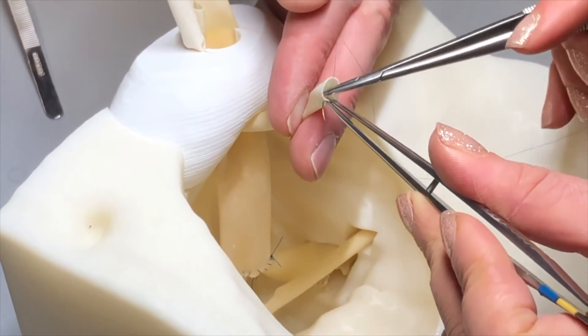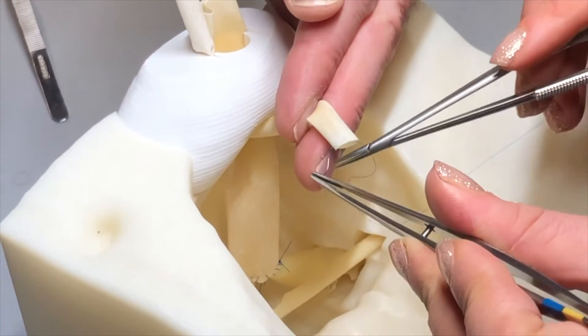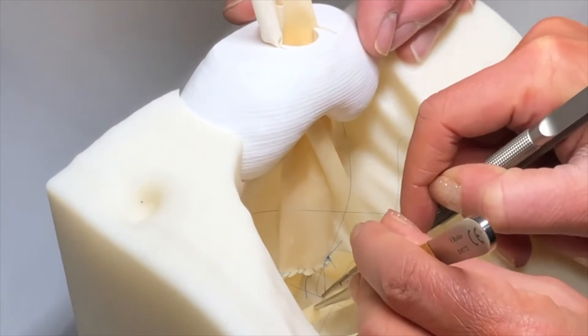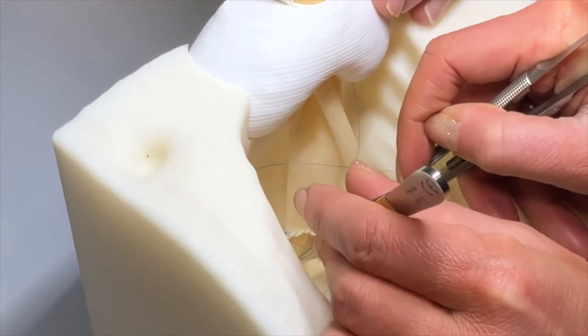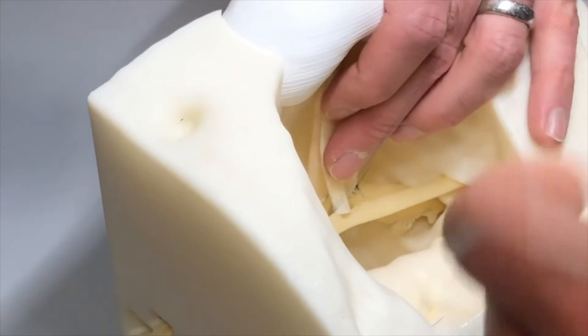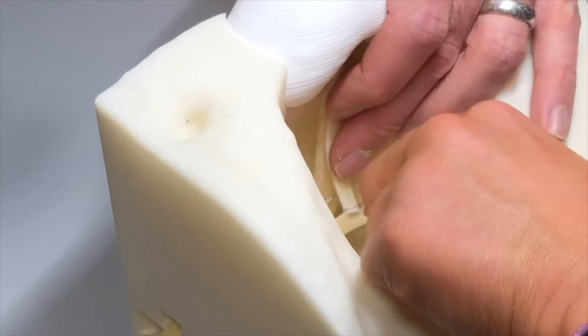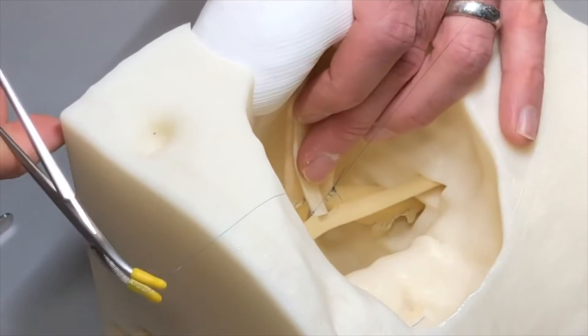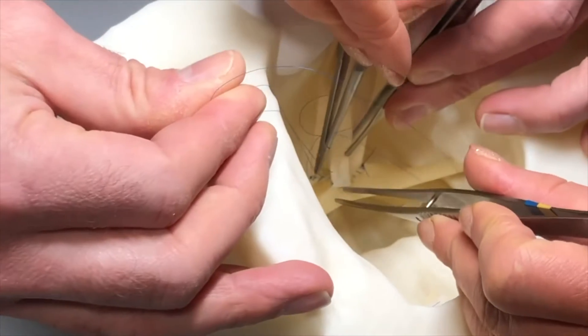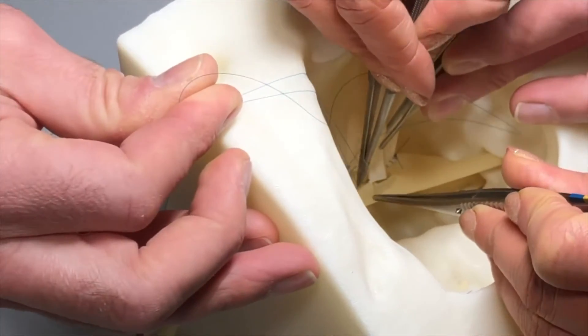Here you can see I start with my assistant holding up on the donor artery and going inside to out with a 6-0 prolene. I then reload the other needle and go from inside to out on the recipient iliac artery to allow my knot to lie outside of my anastomosis. I then secure the anastomosis by tying down the prolene, making sure to even up the suture tails to allow for easier sewing.